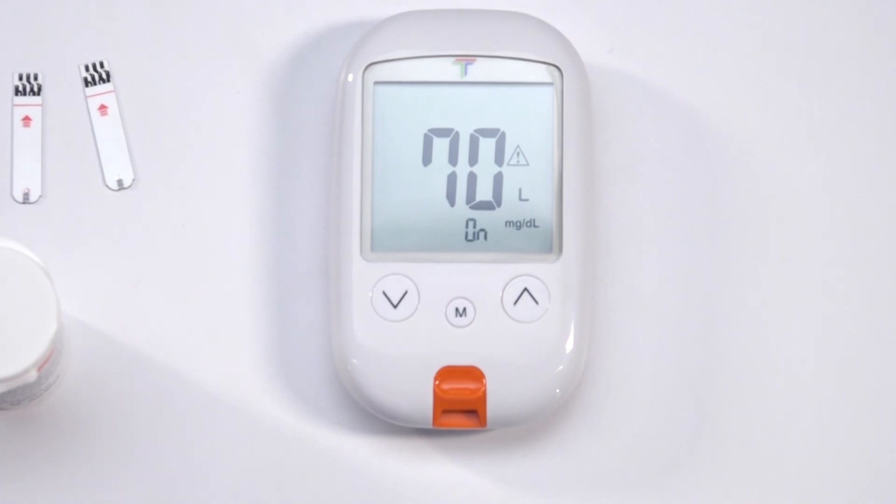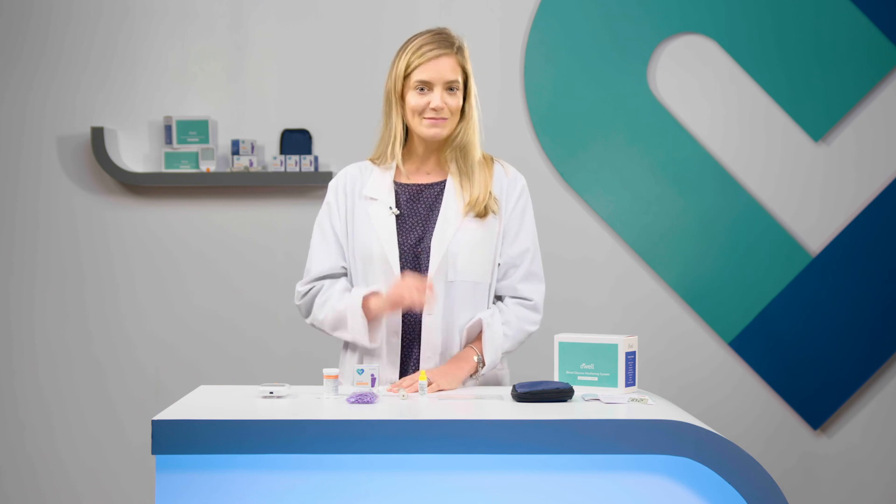The same process goes for the low alert setting, the default being 70 milligrams per deciliter and ranging from 40 to 90. Press M to finish. This will turn your meter off and complete your setup.